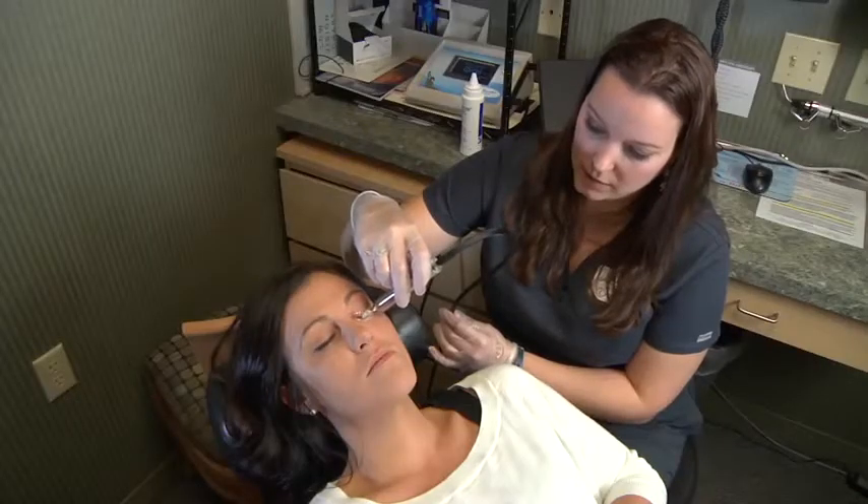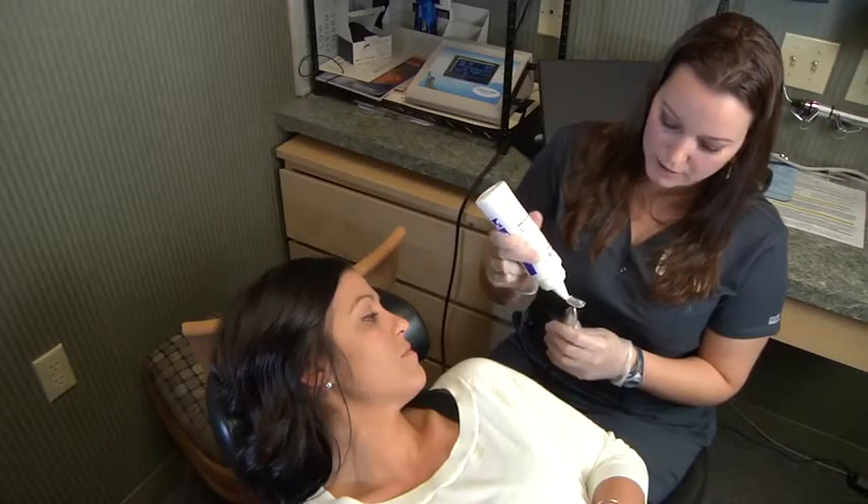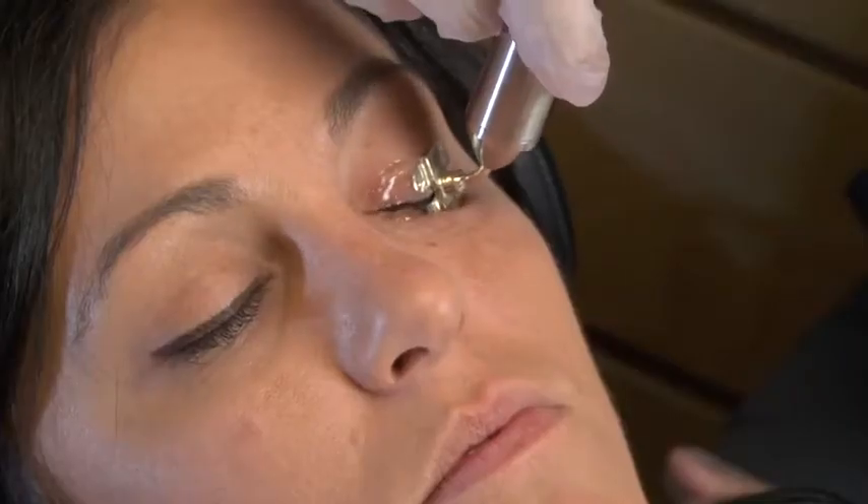Halfway through the treatment, you may feel that the gel has dissipated and you'll want to apply more gel. If you need to add more gel, remove and dab more gel and quickly reapply to the eye.